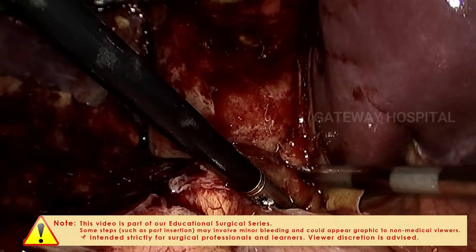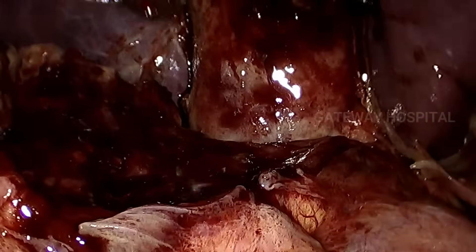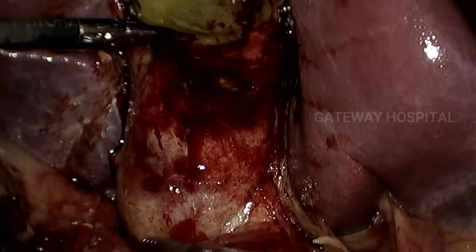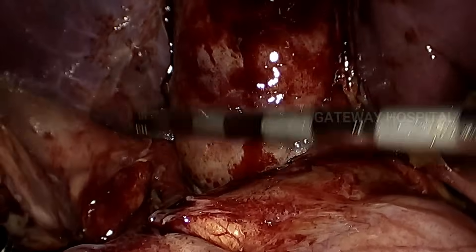We are able to see the entire gallbladder, and if possible try to identify the Rouvière's sulcus — you can appreciate the Rouvière's sulcus faintly.